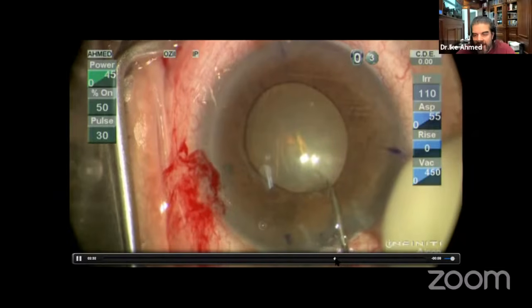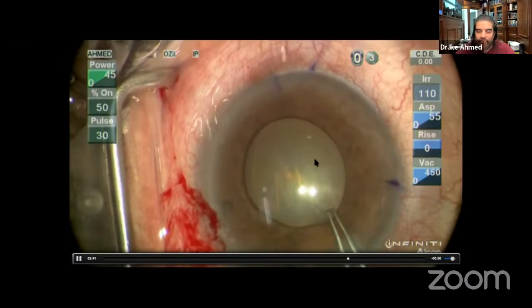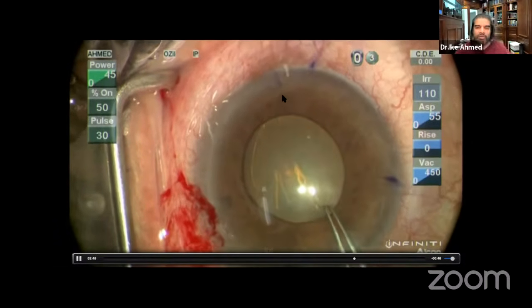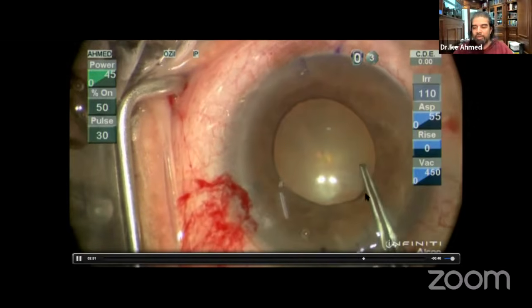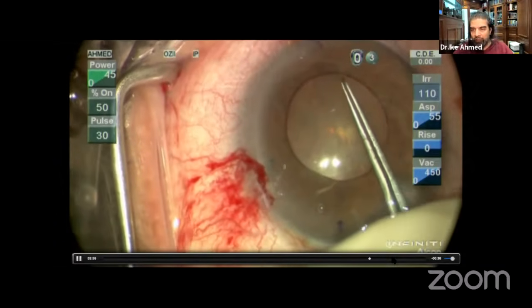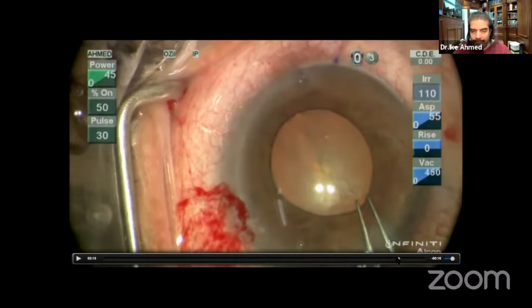This flap is then grasped, and then the capsulorhexis is rejoined to where it ran out. It's helpful to let it run out a little bit as it's going toward the area of run out to allow it to sort of meet the apex of where it ran out. But sometimes we have to resort to these situations to allow the capsulorhexis to continue, or one can convert to a can opener, of course, as well. So to cut and then reconnect is another option as well.